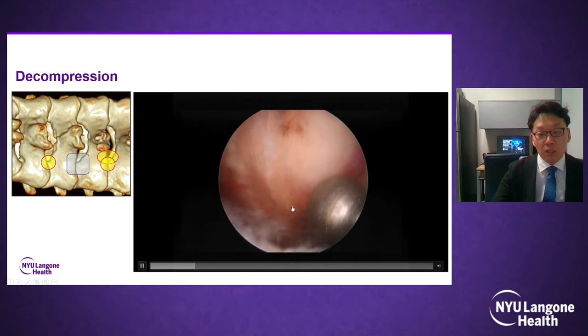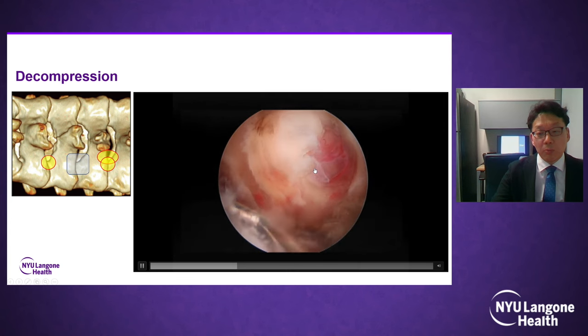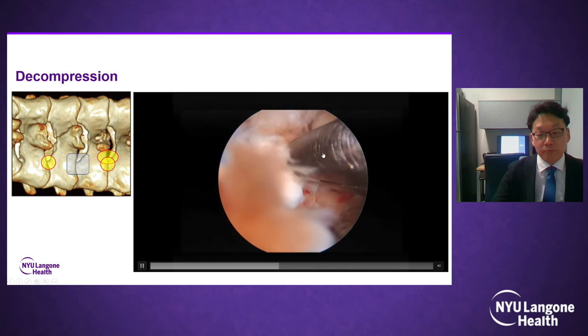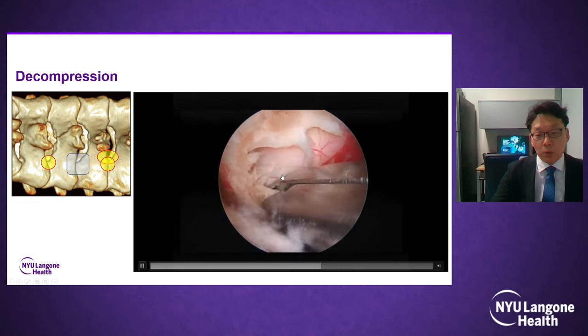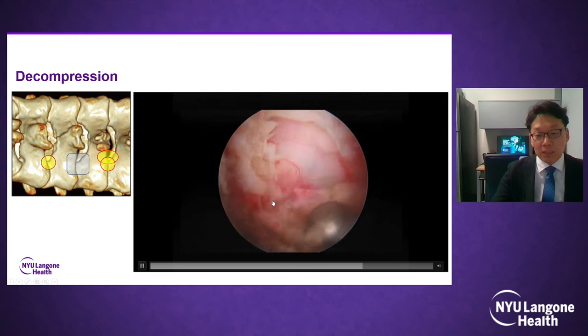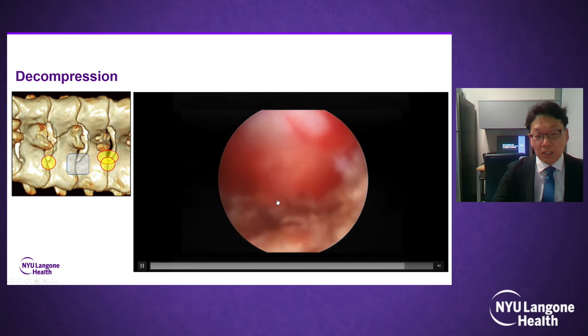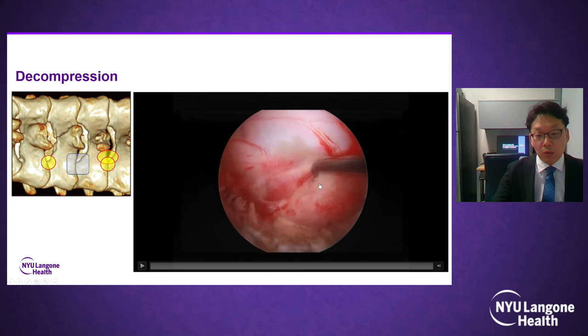Laminotomy on the lamina, and the ligamentum flavum is removed. Then you can see the spinal cord and the dura over there. After removing the ligamentum flavum, you can see the central portion, and then go lateral. Slightly, piecemeal, step by step. Go lateral. And you can find the starting point of the root. With the sharp hook, you can peel along the upper and lower pedicle and the passage through the foramen. And you can remove this point.